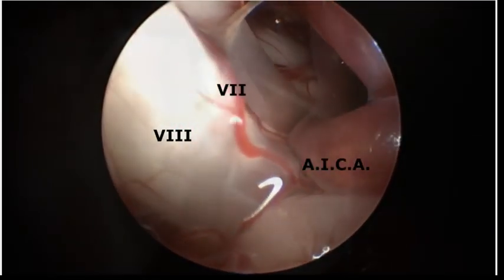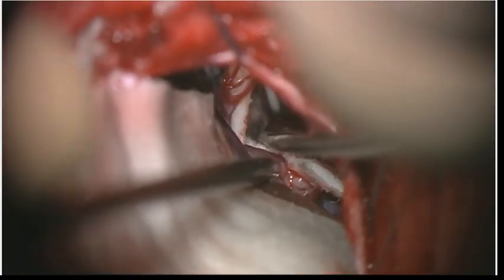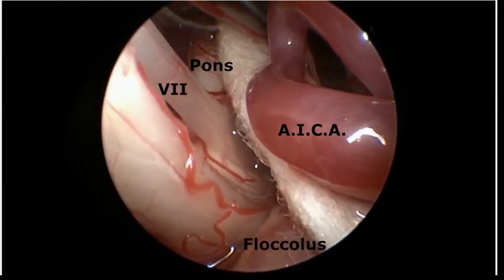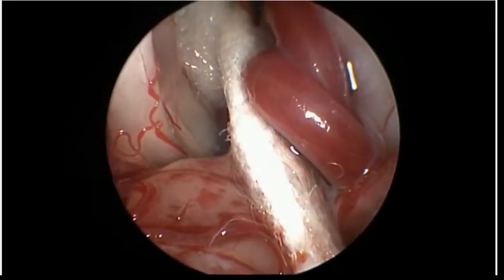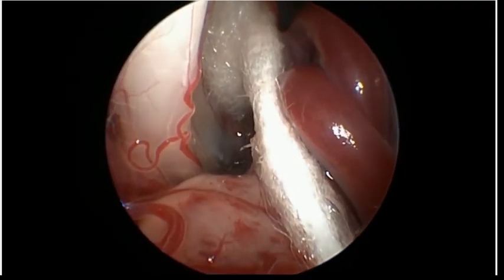Alternatively, a Teflon bridge is placed parallel to the brainstem surface between the lower pons and the flocculus, shielding the root exit zone from the compressing vessel. Often, an additional piece of threaded Teflon is placed as a pillar to increase the distance between nerve and vessel.